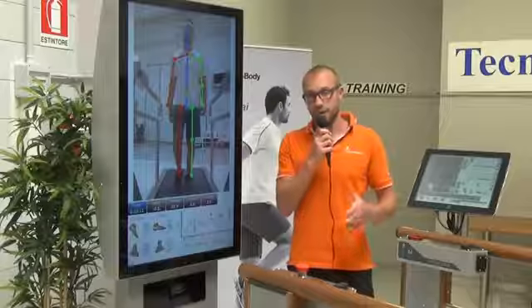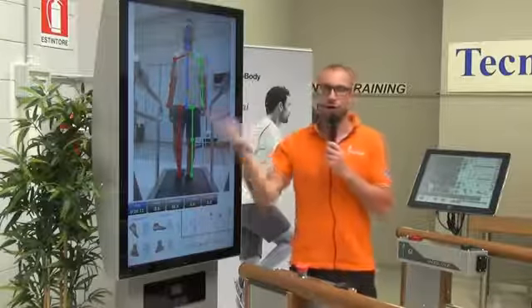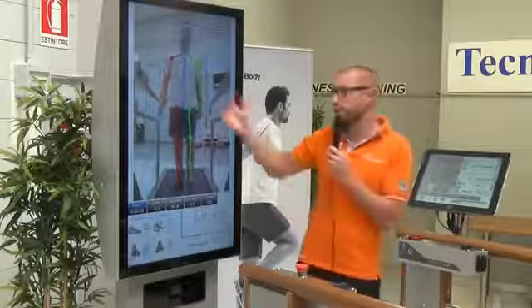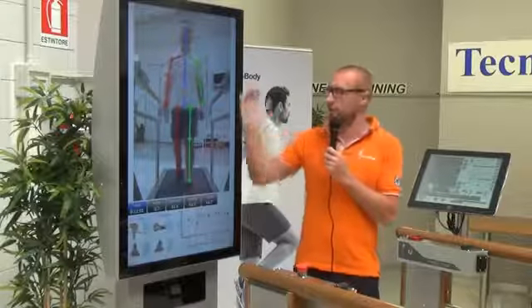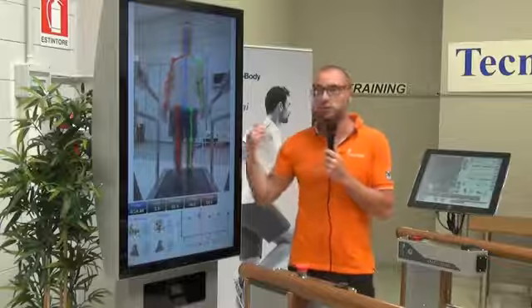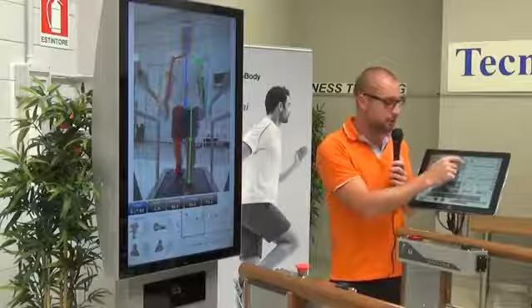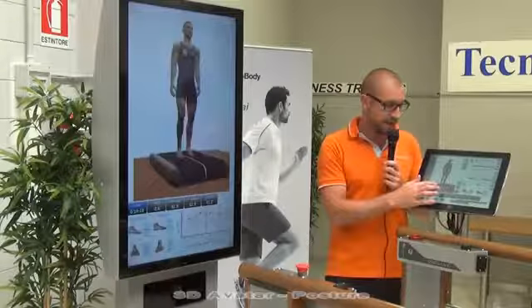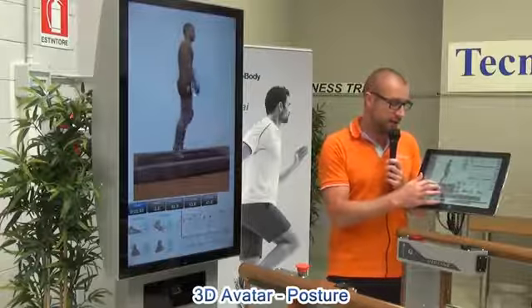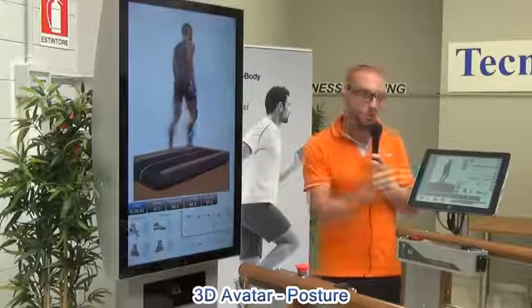Another feature of the Walker View is about the reconstruction of our user, of our patient, in 3D. So during an instant replay, we can show, of course, the frontal plane, the frontal view, but if we want to show him as well another view, a 3D view, we can switch through the touch screen to an avatar. So automatically the camera is going to reconstruct the patient in 3D, and we can show our patient another view of the test, of the kind of walking.